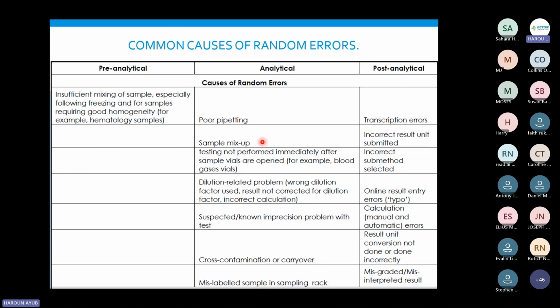When you are here now, you're not sure which sample was A and which was B. So do those pre-analytical steps where, for the lab, you label the tube first and then you reconstitute. Don't label A and B at the same time and then start putting things inside them. If you're focusing on sample A, just do sample A, reconstitute, put it on the analyzer in the correct position, and so on.